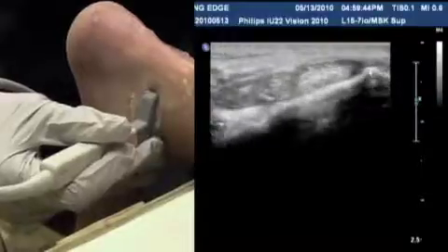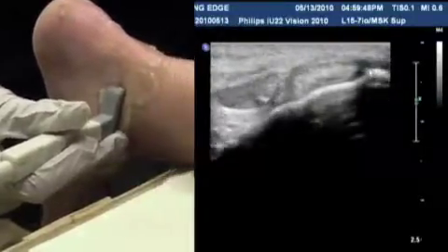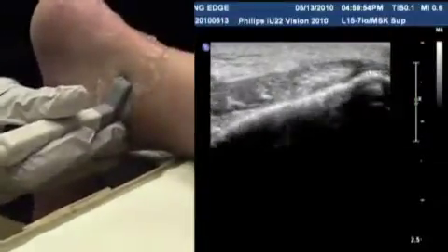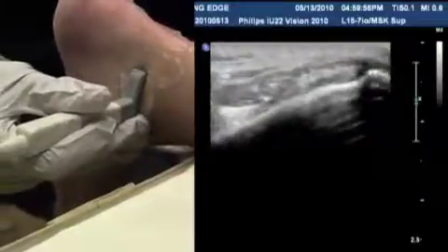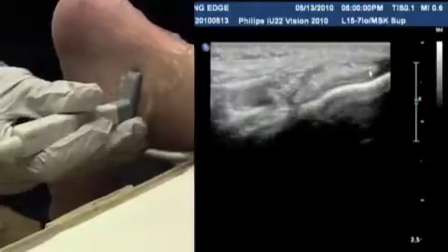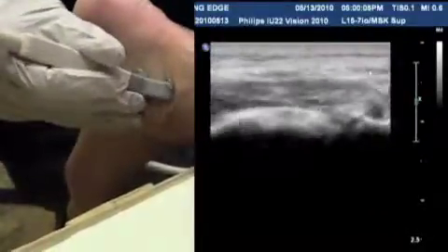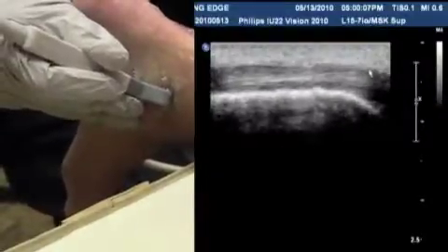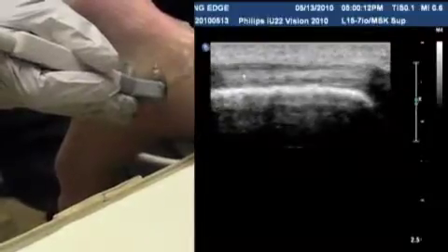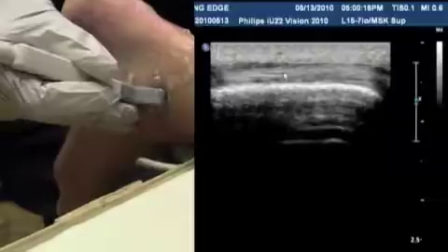And then as you scan down, what you find is the tendon appears normal and oval, as we talked before, that's a normal appearance of a tendon. What I do at this point is usually turn long axis, because the tendon is usually going to go down to the foot. So in the long axis, the tendons are going to appear side by side. And there's the posterior tibial tendon, which is seen very well in the long axis with the fibers going horizontal.